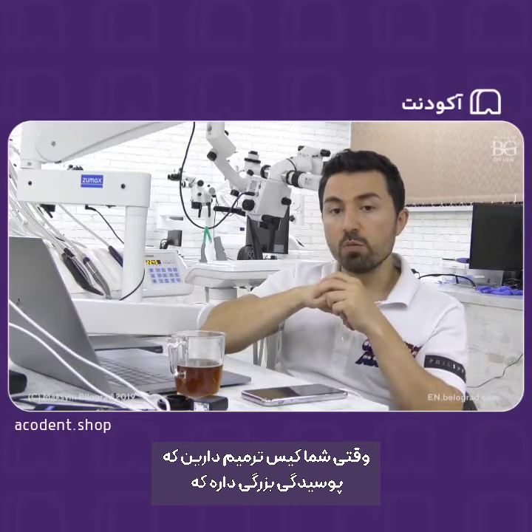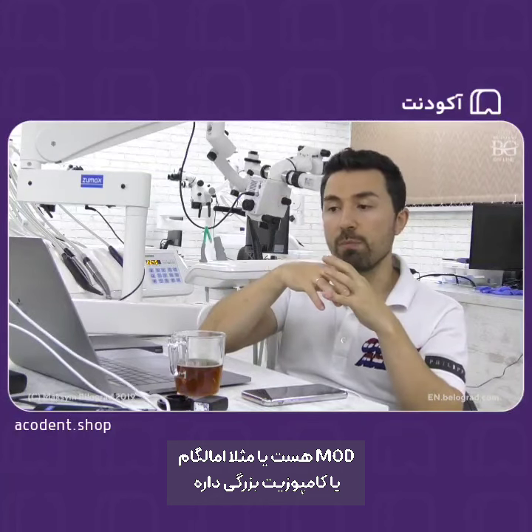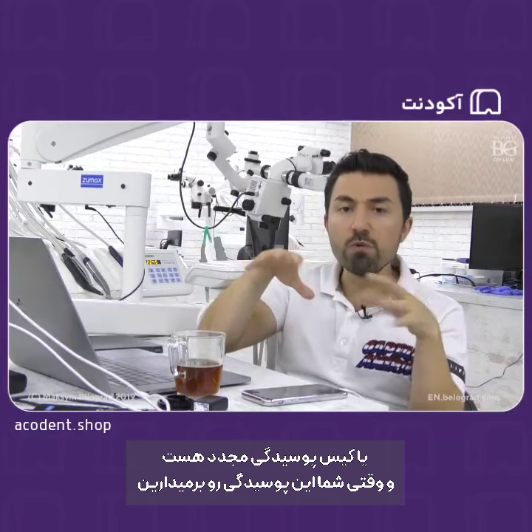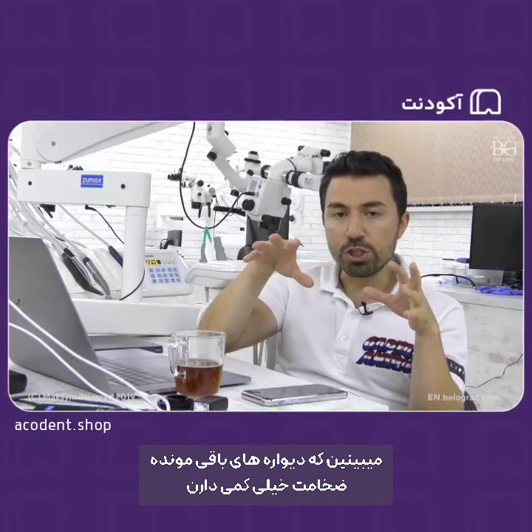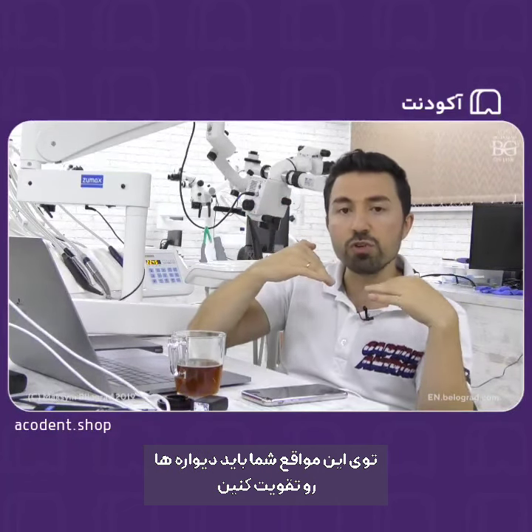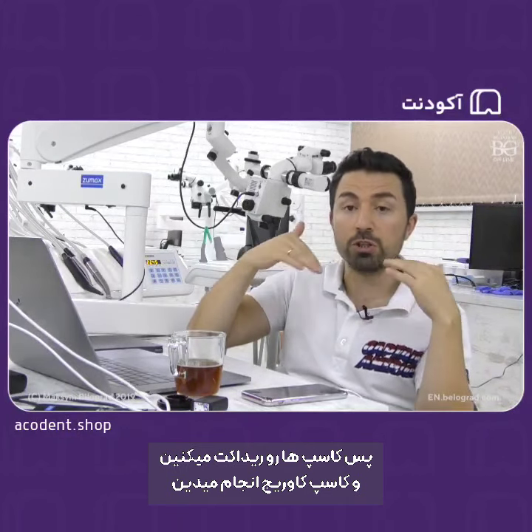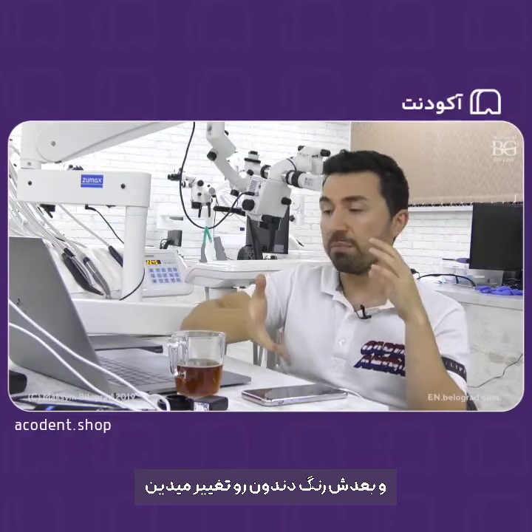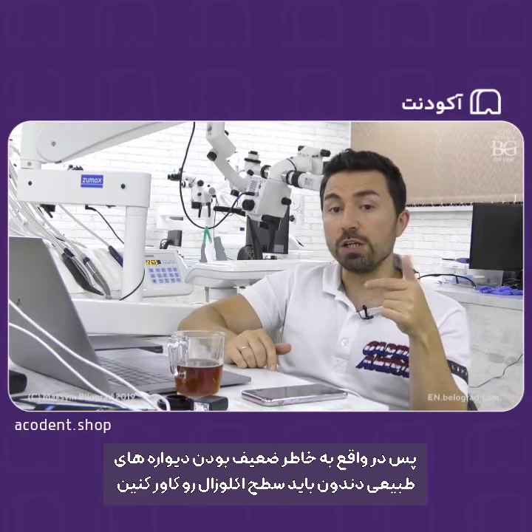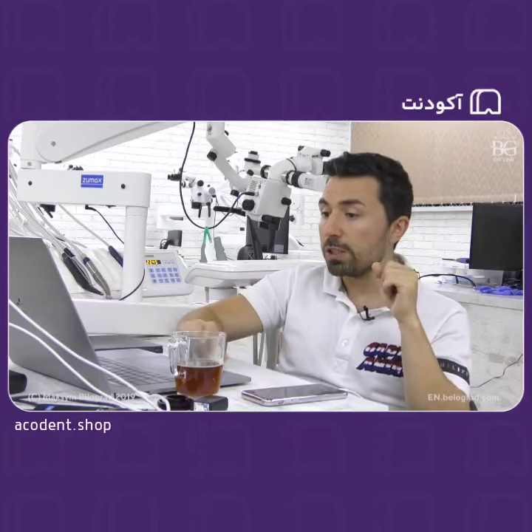And third option, when you have a restorative case and you have a big cavity, big MOD for example, or a big amalgam filling or big composite filling or secondary caries, and when you remove these caries, you see that the walls around these cavities are really thin. In this case you have to reinforce the walls, you have to reinforce the tooth, you have to do cusp reduction and cusp coverage, and then you maybe change the color. So in this case you will cover the occlusal surface because of the weakness of natural walls.